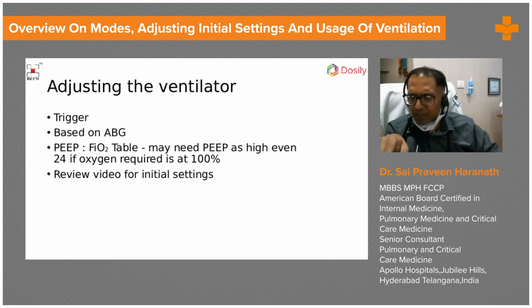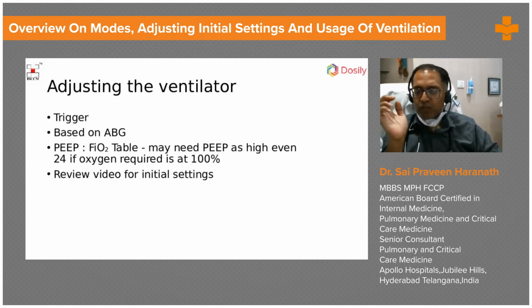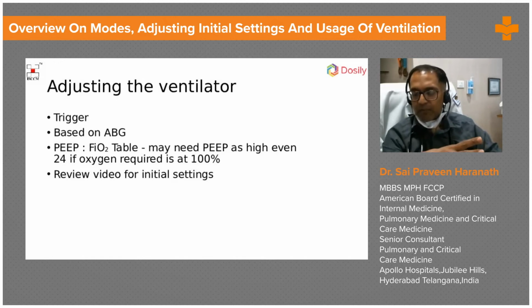Somebody asked briefly, what is plateau pressure again? Briefly, we'll go over this again, but the concept is, it is a measurement of the pressure inside the alveolus. It is a pressure that is being seen by the alveolus, and you want to make sure that number doesn't exceed 30. The lower the better, to make sure that you're not damaging the lung, because there is a concept of barotrauma where the lung can collapse when you give too much pressure.